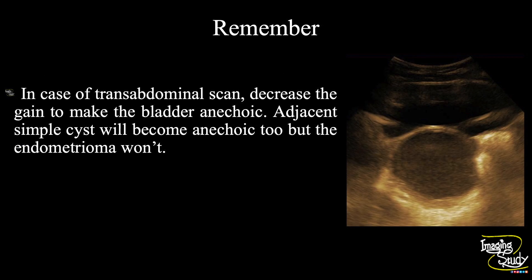The take-home message: in case of transabdominal ultrasound scan, decrease the gain to make the bladder anechoic. When you have made the bladder anechoic, an adjacent simple cyst will become anechoic, but the endometrioma will still look hypoechoic. This appearance may help confirm endometrioma in a poor-quality machine setup.